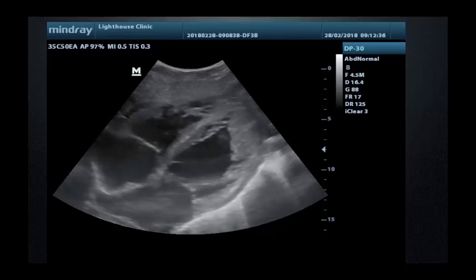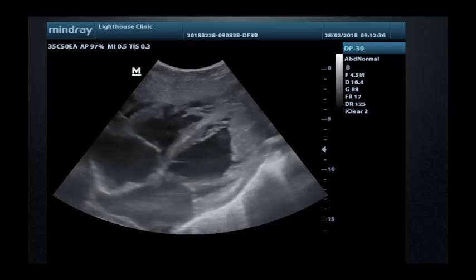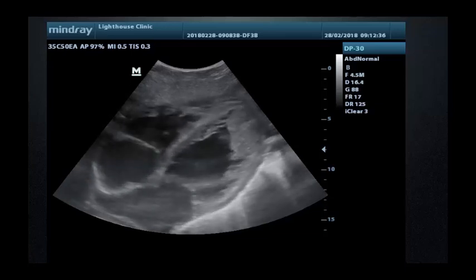But very often in these cases you see small and shrunken echogenic kidneys, which can point you towards a case of secondary renal, kidney-induced hypertension, or the other way around, that these kidneys are already severely damaged by the long-standing hypertension. So definitely in any case, it would be good to have an ultrasound of the kidneys and to have a creatinine and renal function tests to see where this is going.